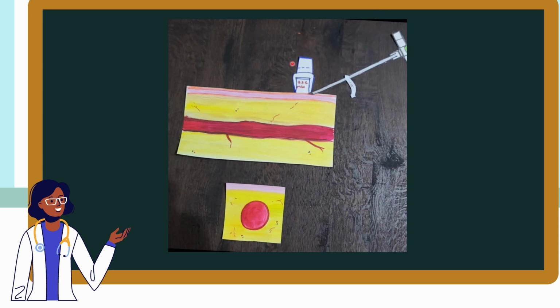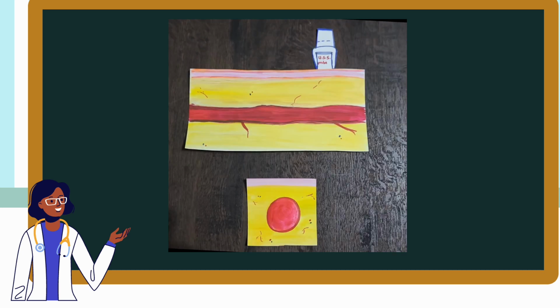This initial point at which the ultrasound is placed is prior to insertion of the needle. Seen below, the vessel is noted in the center of the ultrasound image. The needle is then introduced into the tissue at a 30 to 45 degree angle in the direction of the probe. Let's take a look.